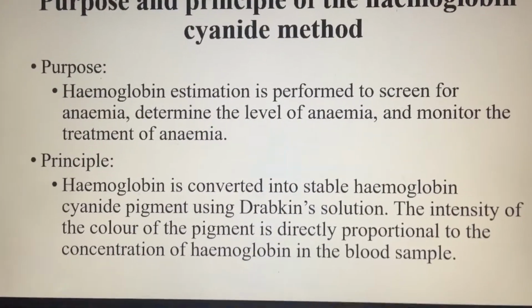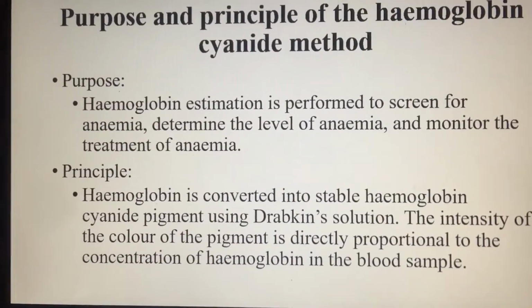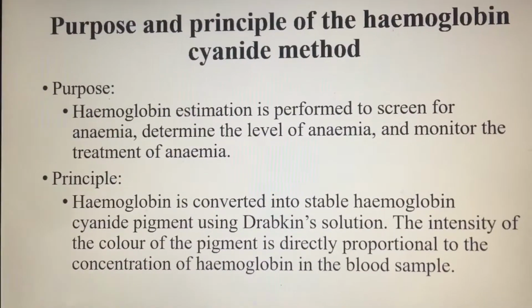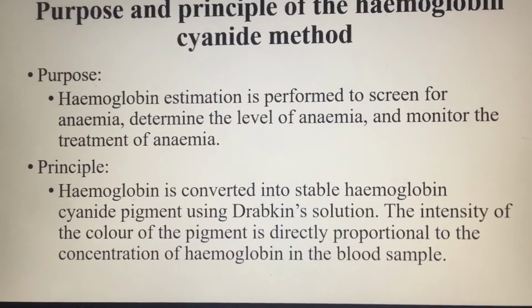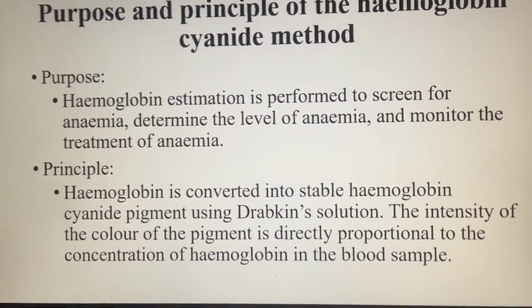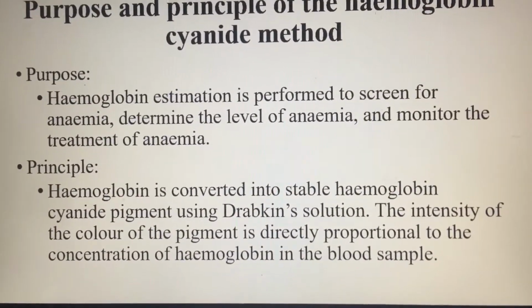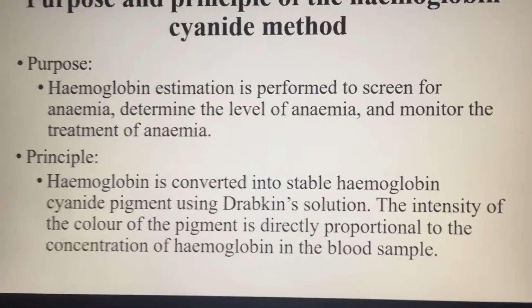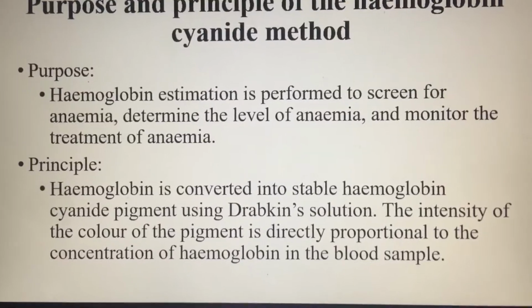When we measure the optical density, or the absorbance, of that solution, that optical density is directly proportional to the concentration of hemoglobin of the blood sample.